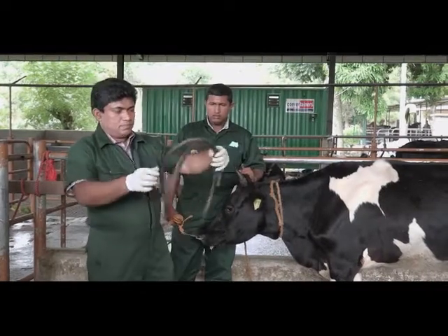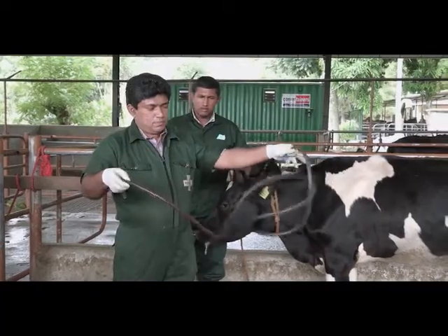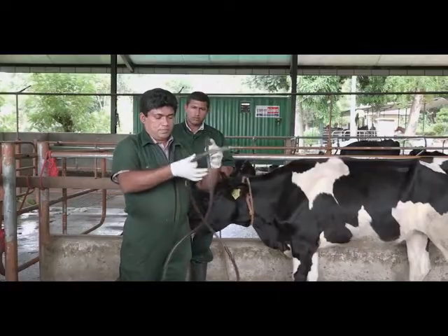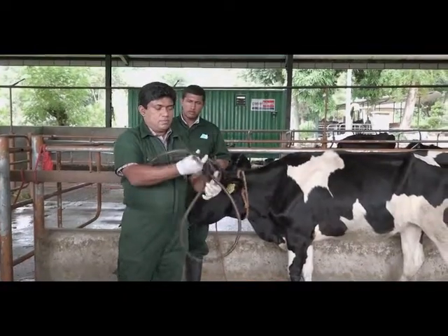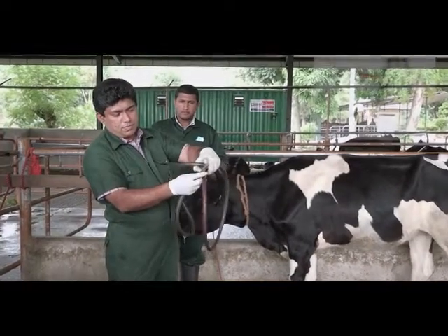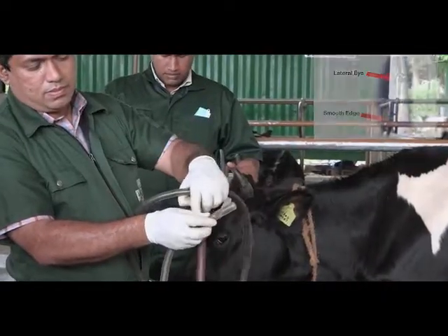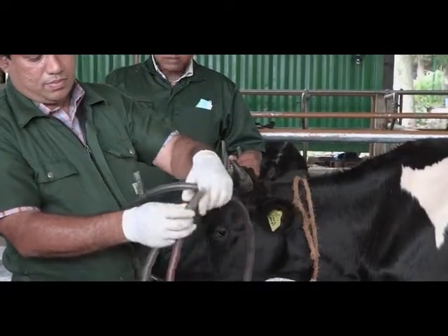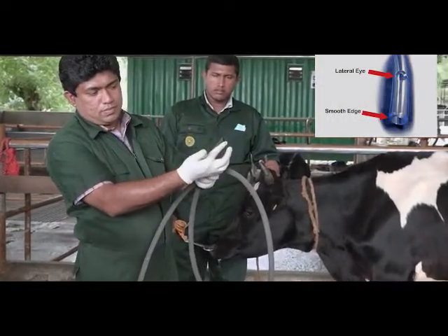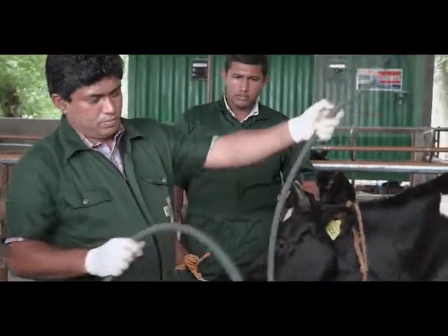Alternatively, you may use a stomach tube. Before inserting the stomach tube, the head should be restrained properly. Here we have used a bull holder. This is the stomach tube we are going to use today. Make sure the stomach tube has a smooth edge to avoid injuries to the esophagus. Also, you may select a tube with a lateral opening or a lateral eye to facilitate passage of the drug into the rumen without any blockages.